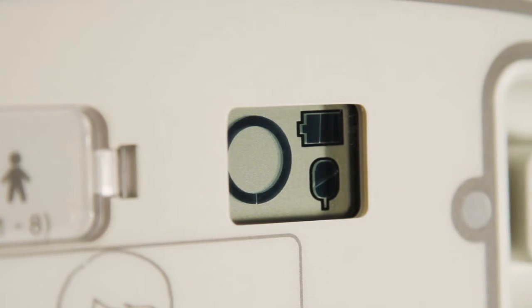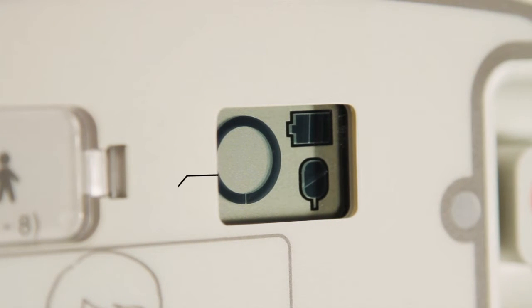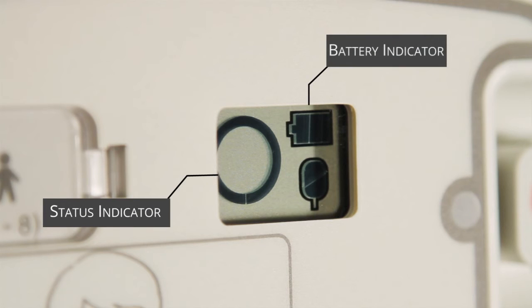This window should show three key things: one, a status indicator; two, a full battery indicator; three, a full pads indicator.